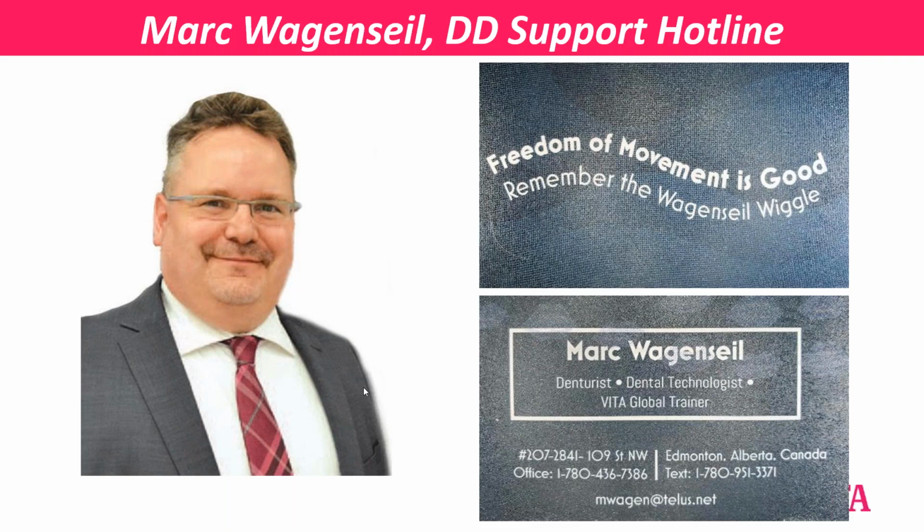So by looking here, that opened the conversation and I was able to realize, and then he realized, and treatment is more successful because then I'm watching how much I'm changing for him. How much do we change the vertical? All of these things that I can do to try and make the case more successful. It's been an eye opener for me. You are building it for the person. You need to identify that. Your doctor needs to identify it. And then you have to use product that allows you to be flexible.